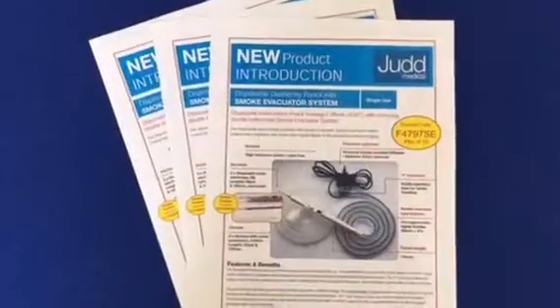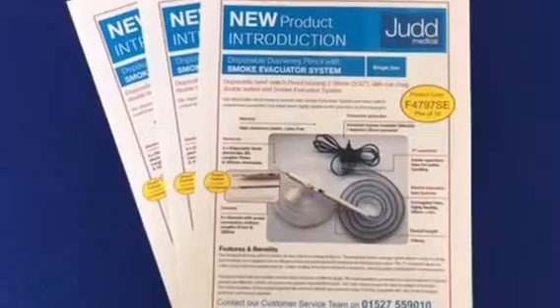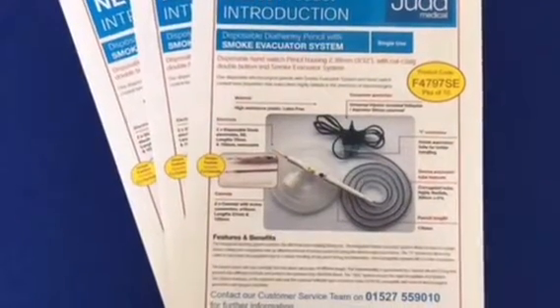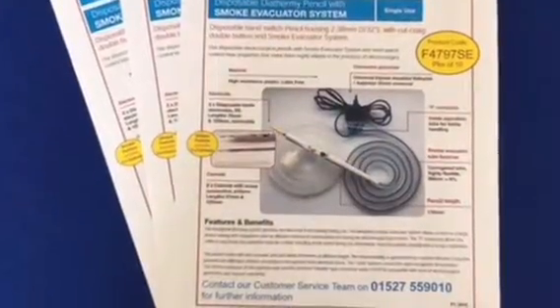Where hospital policies and procedures for surgical smoke safety are being developed, this disposable electrosurgery pencil will provide a smoke-free area and aid the perioperative team to establish a safe working environment.